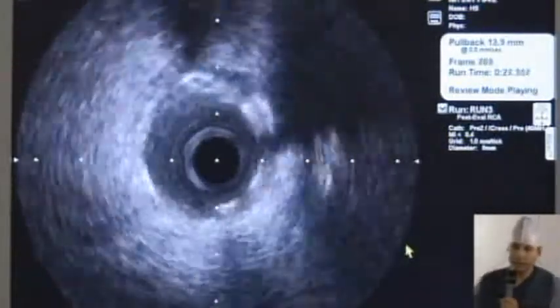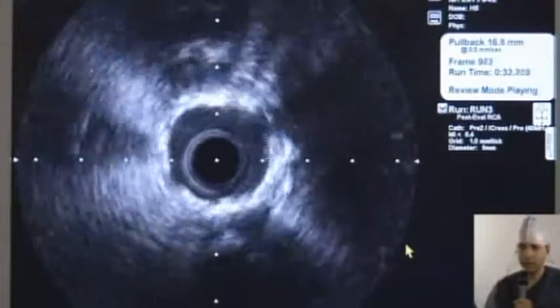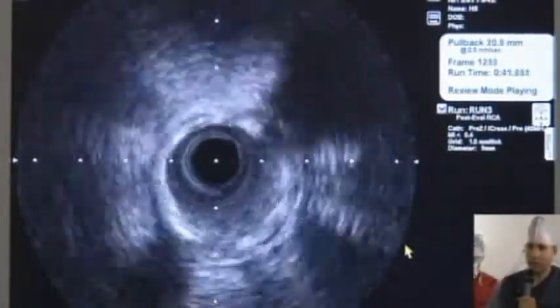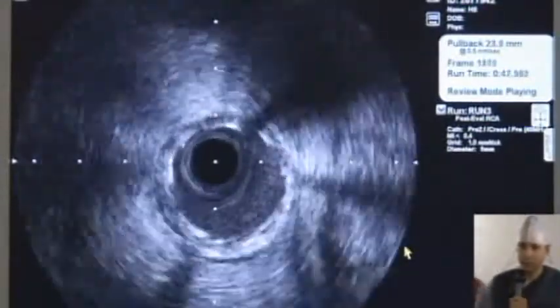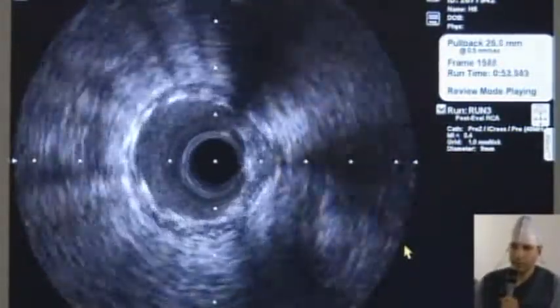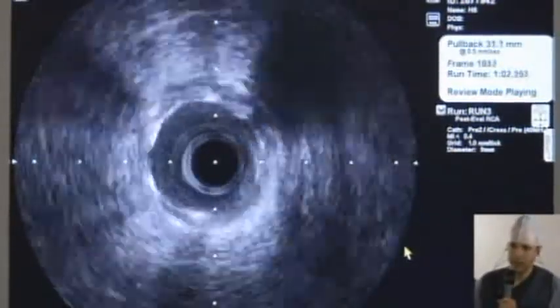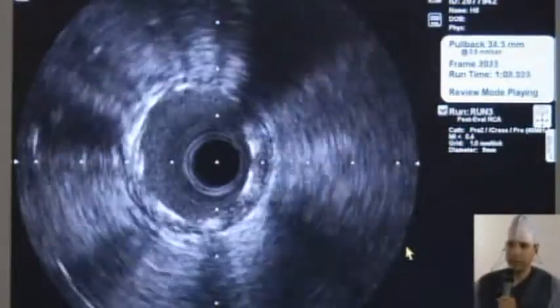As you said, it's a full metal jacket. And there are some spots where we can see the calcification, the calcium behind the struts, and sometimes it distorts the stent a little bit and impacts the area a little bit. But overall, we consider it a good expansion after the non-compliant balloon, which was up to 16 atmospheres. So here we're probably in the transition between the two distal stents. So we just saw the overlapping area. And here's some of the calcification, but overall it appears to be an adequate expansion.